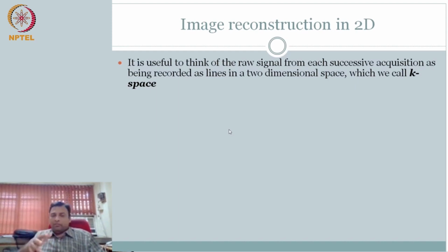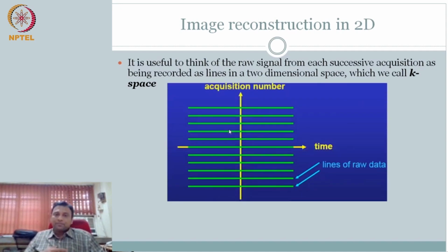But the way we have covered, your U is Kx, V is Ky. So you just have to be careful. Whatever we are covering is correct. If you are reading different literature from different backgrounds, they may call this K space. Essentially, K space is similar to what you have, just denoted as K space because of the jargon of wave number rather than frequency.